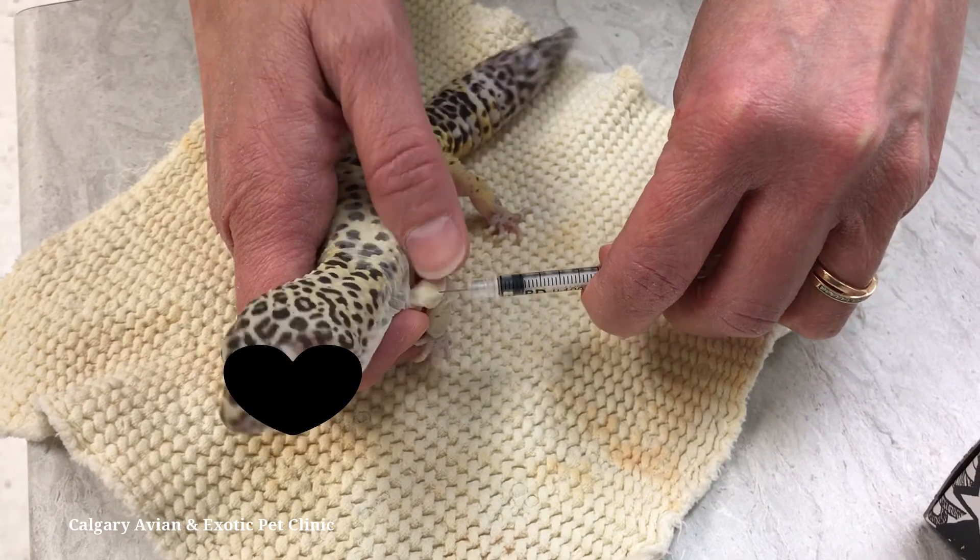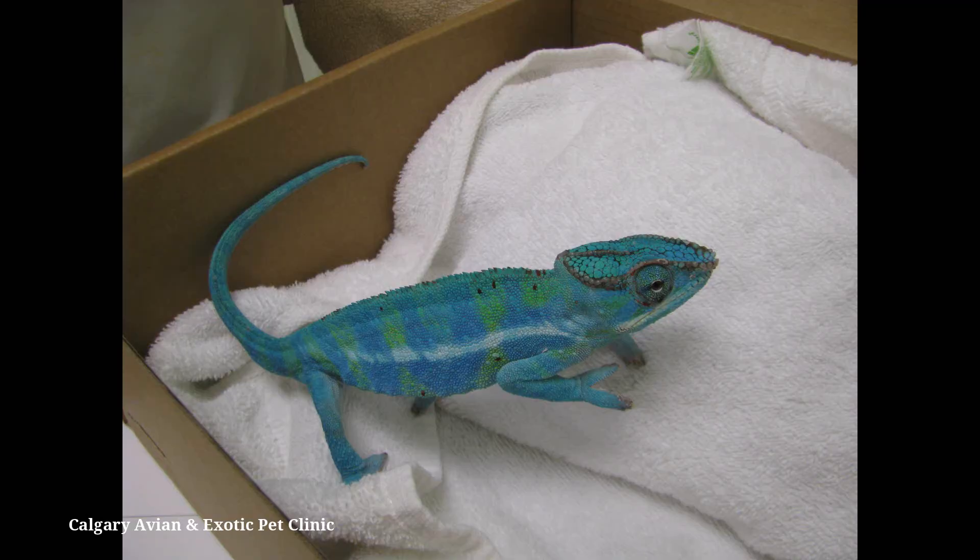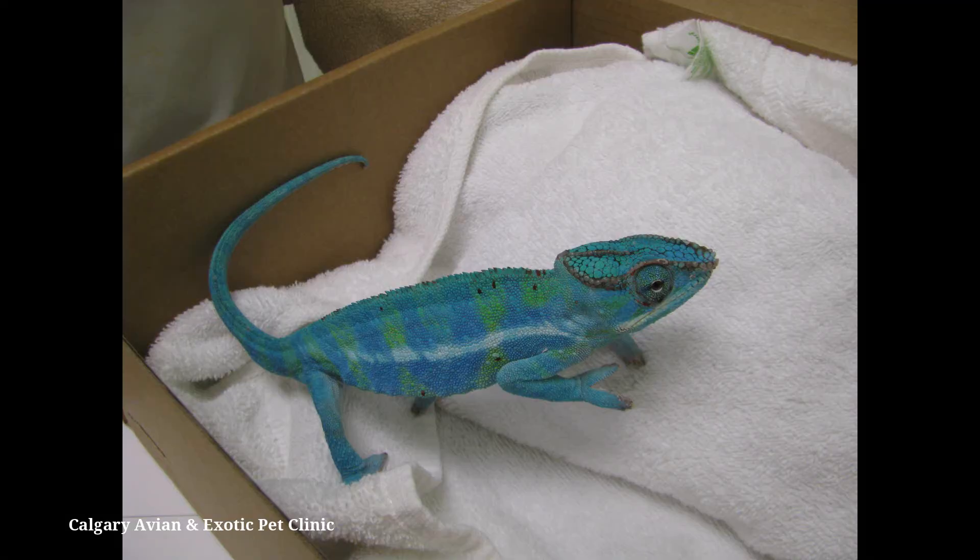Please note that chameleons can often have a localized color change to the skin following the injection. This usually resolves within a few hours or days but could last weeks.